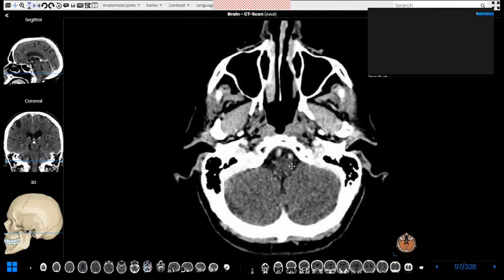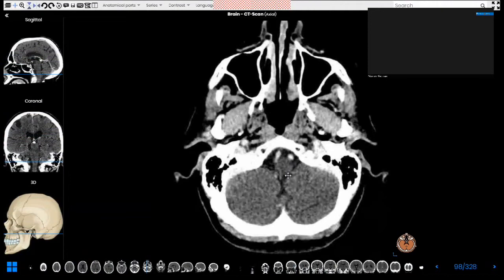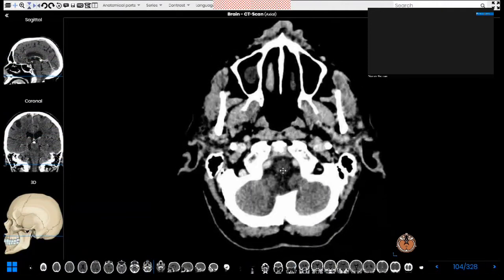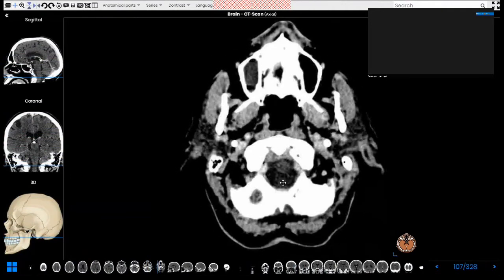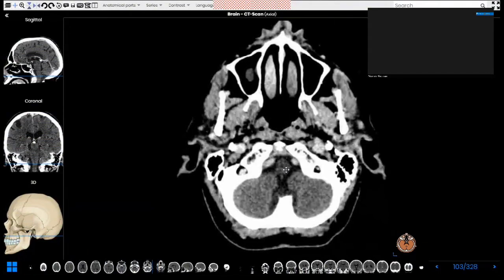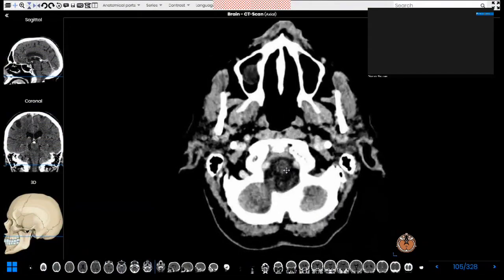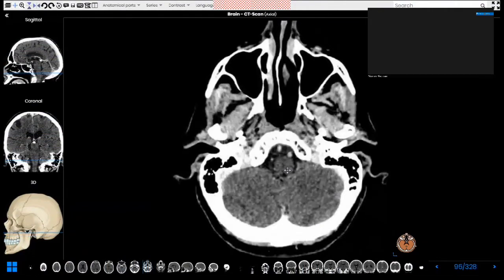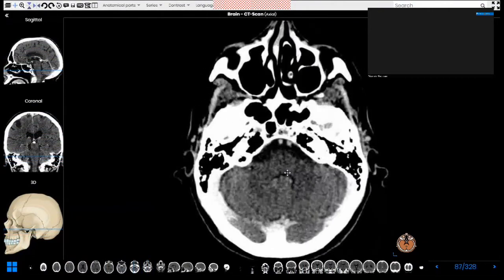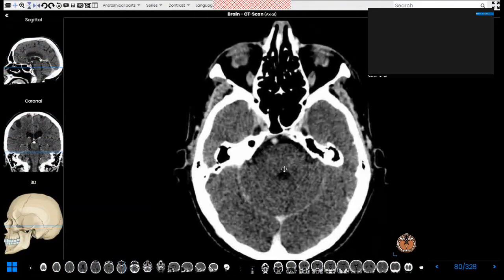At this level we can see the medullospinal junction. This is the uppermost aspect of the spinal cord, which is connected to the medulla oblongata and the rest of the brainstem.